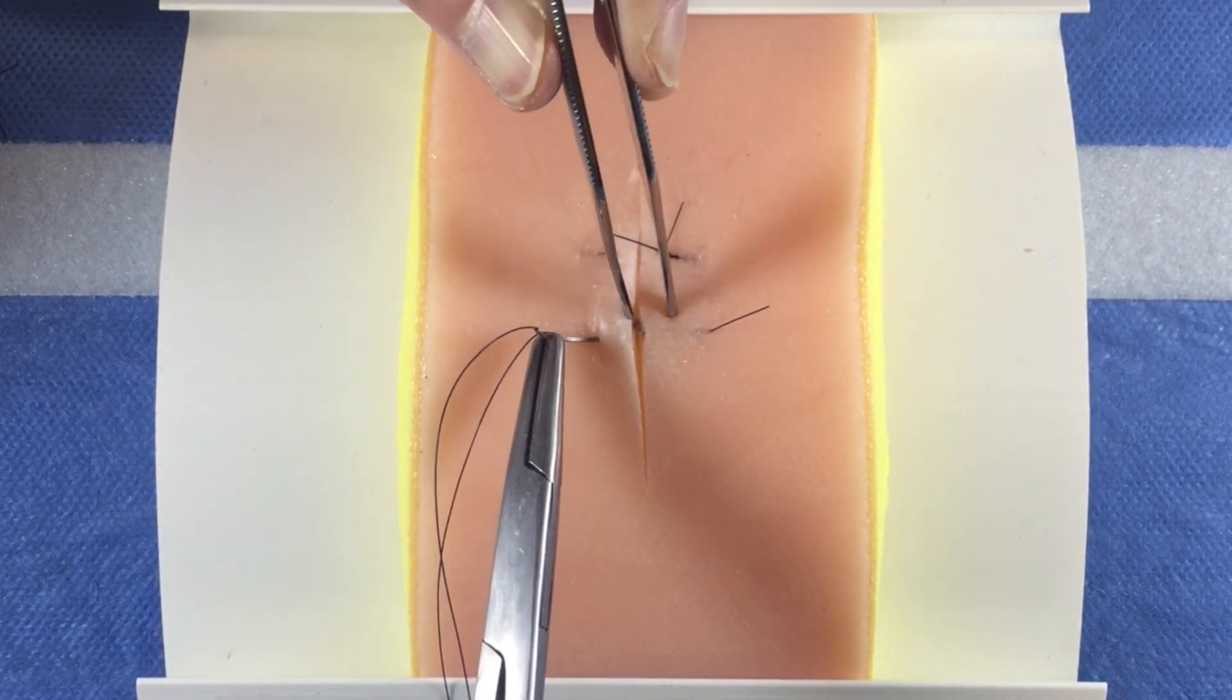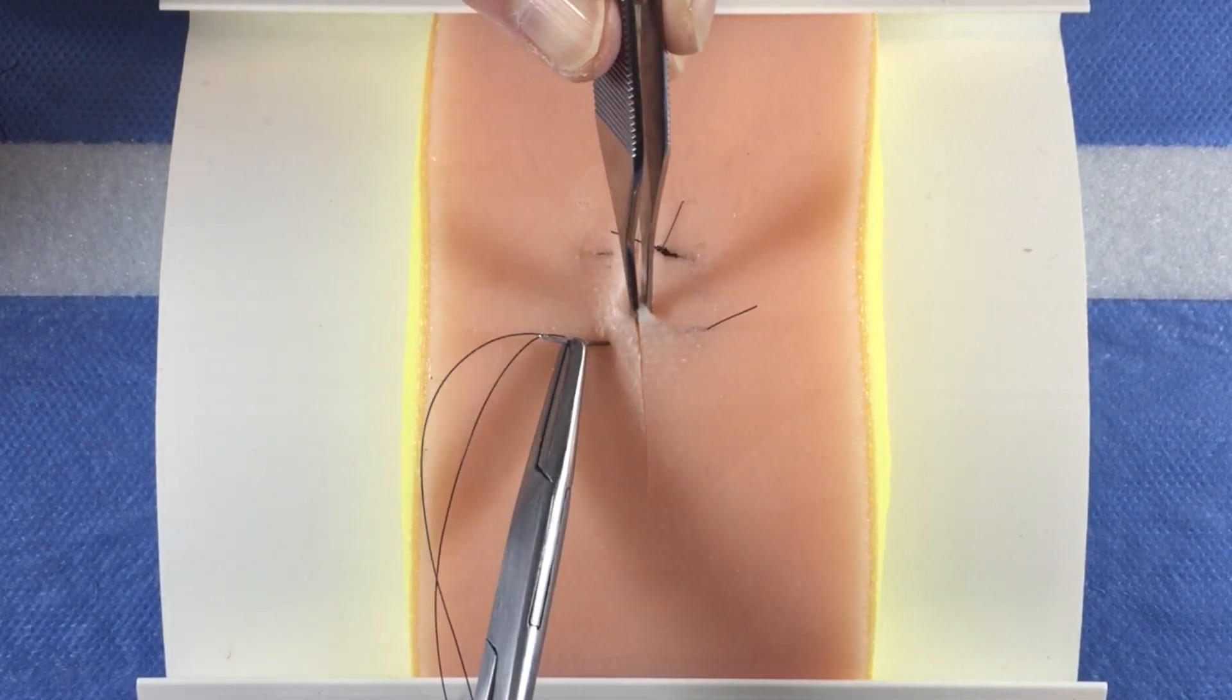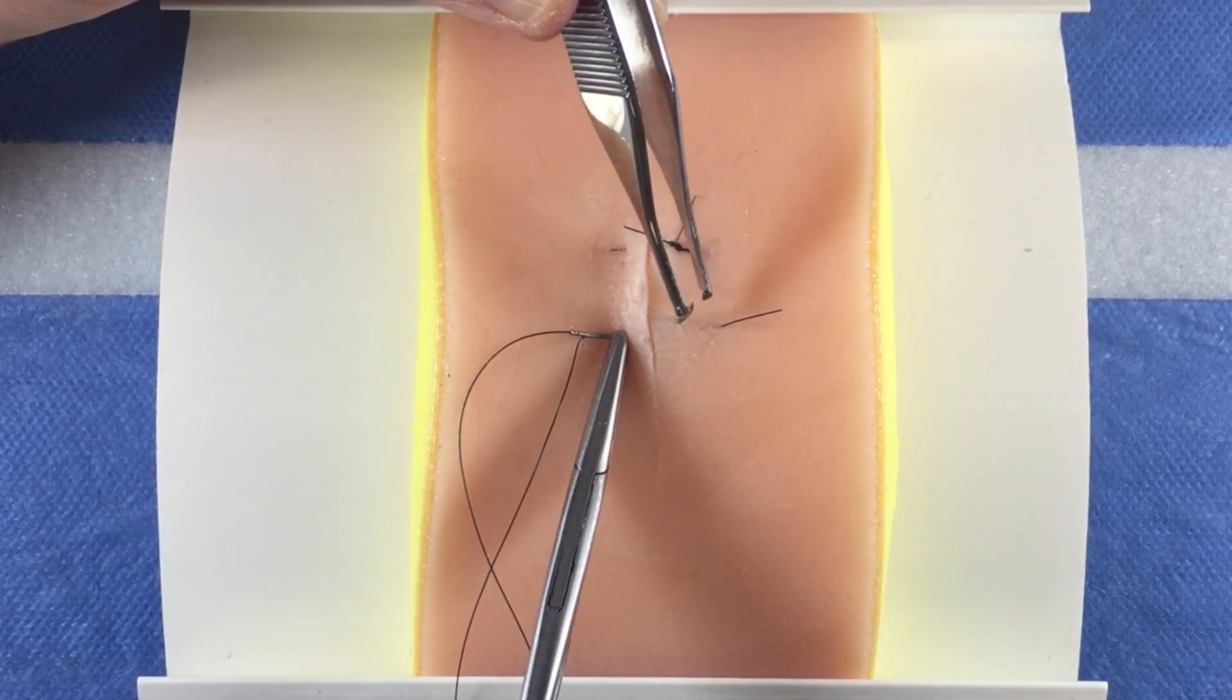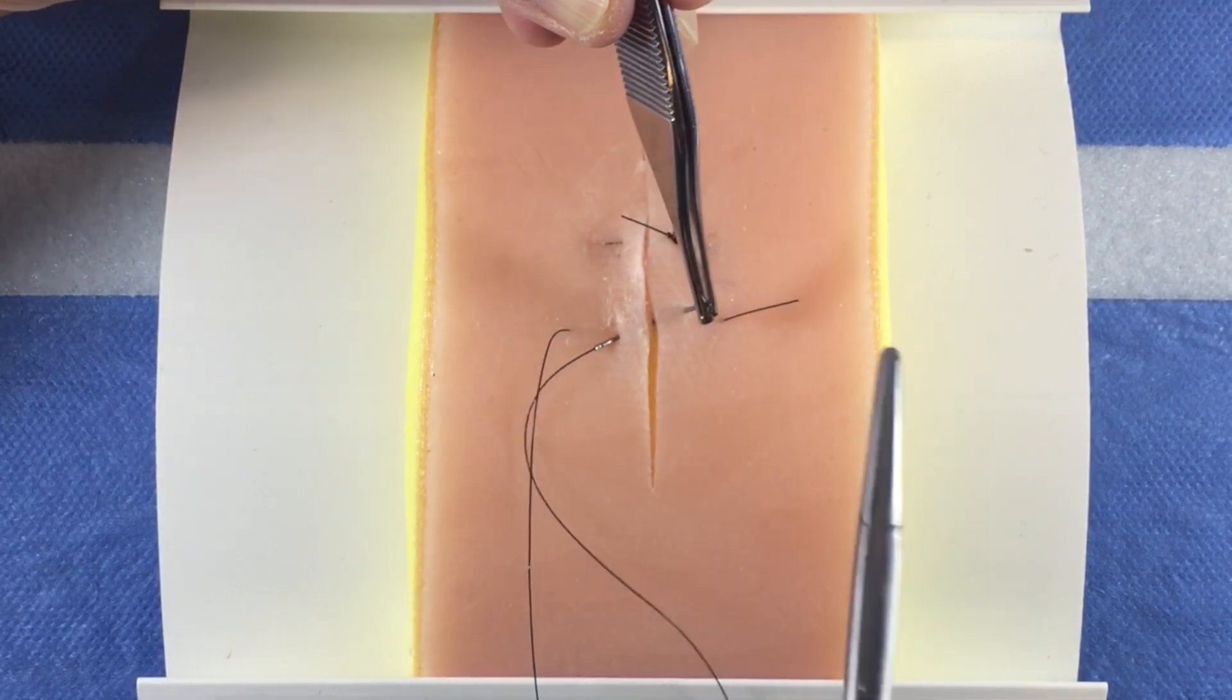At a distance closer to the skin edge, drive the needle through, this time at a more superficial depth, and come out on the other side.